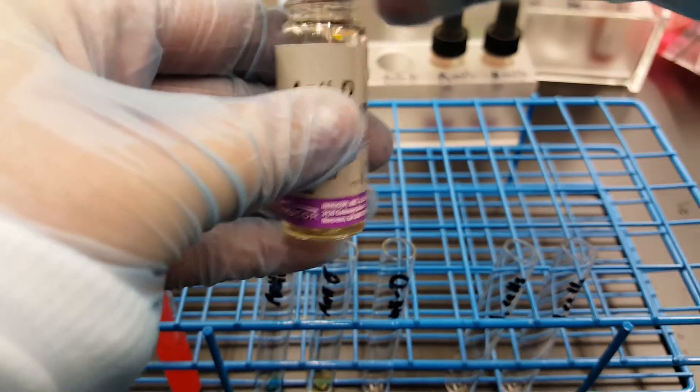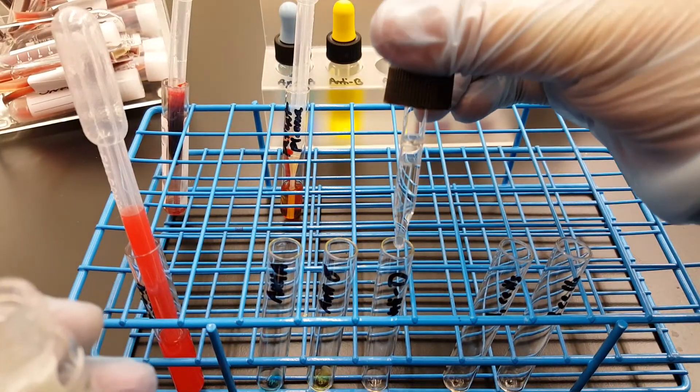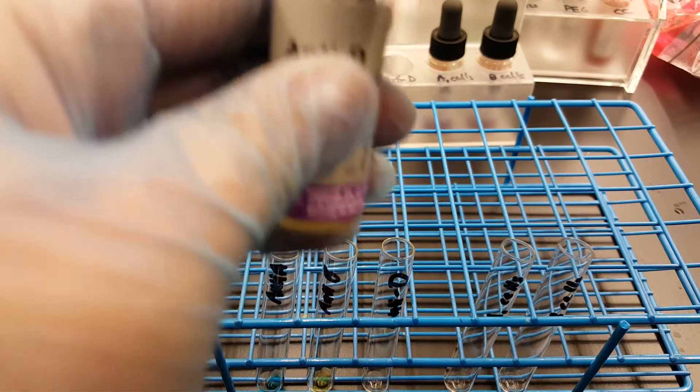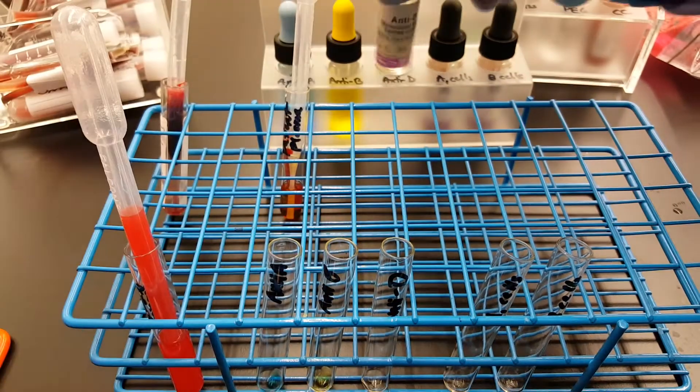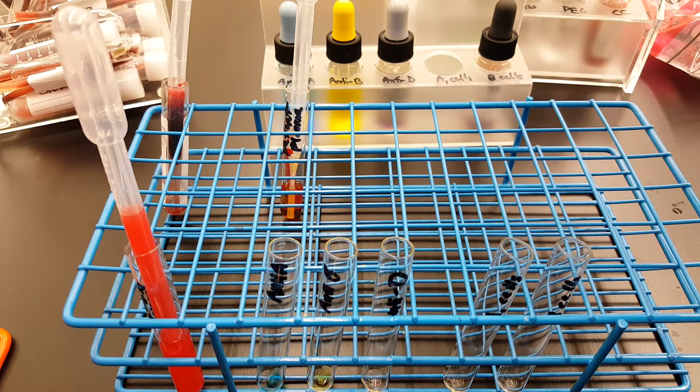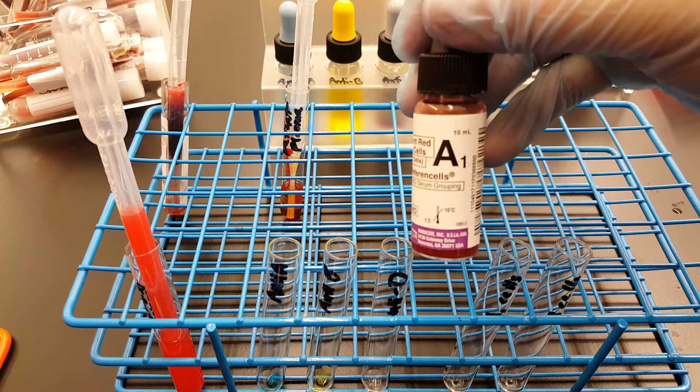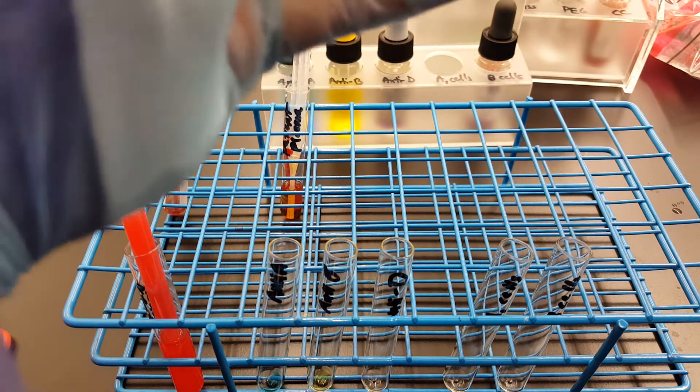I'm going to do one drop of the A1 cells reagent.